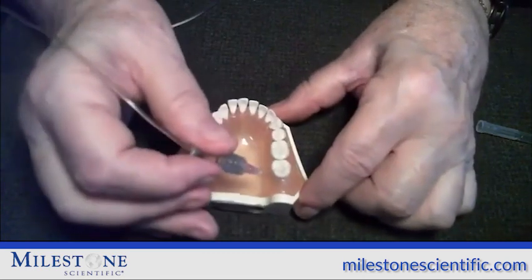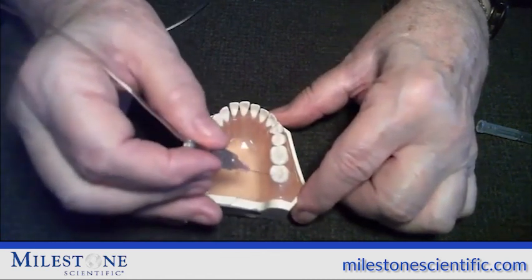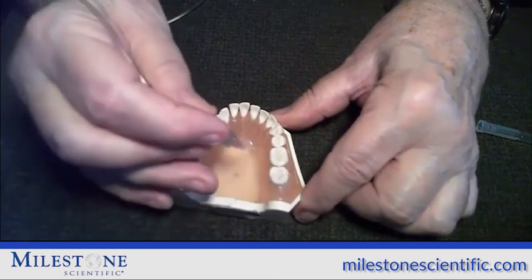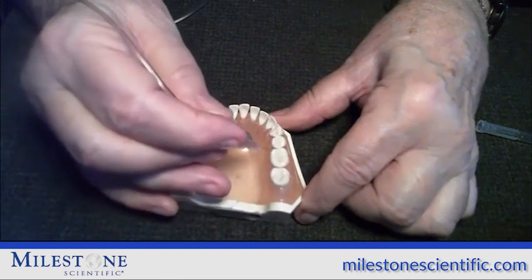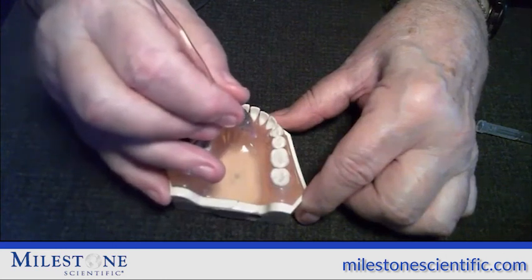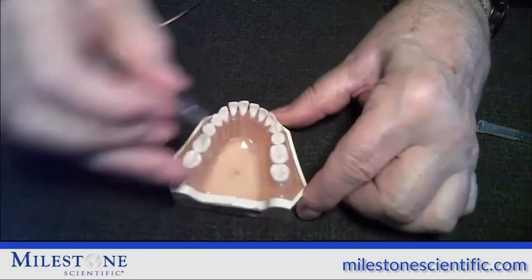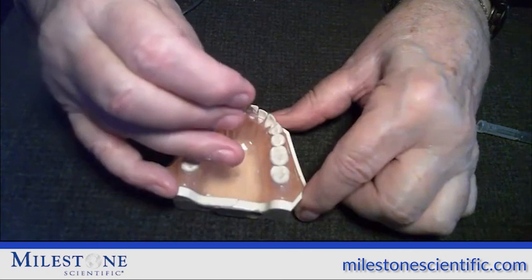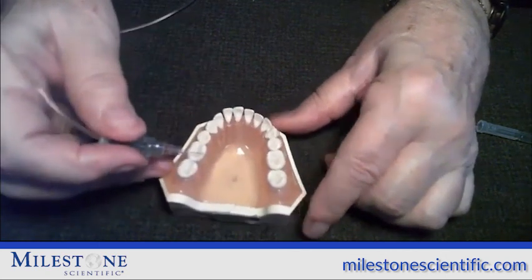To anesthetize a full quadrant, you could anesthetize the second molar with 2 injection sites, full cartridge of anesthetic. Skip the first molar and then go to the second premolar, 2 sites, distal, then mesial. It's very important to always start on the distal and then go to the mesial. Now you've anesthetized the whole quadrant. Sometimes you might have to give the supplemental anesthesia, maybe 10 drops on the distal of the incisors. Sometimes you don't need to.